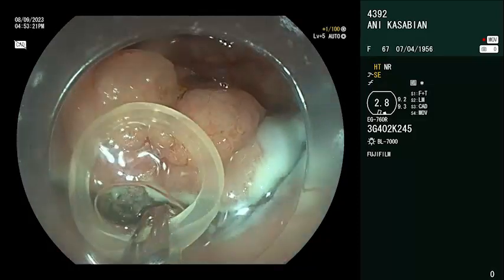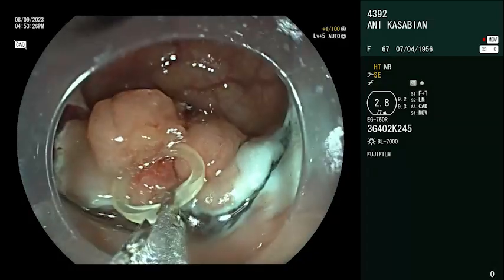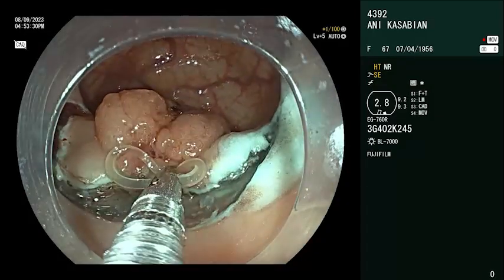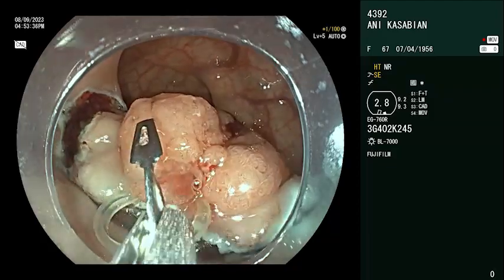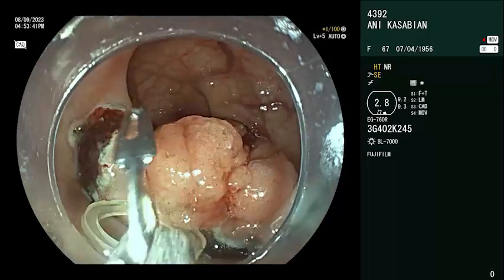Then I will grasp the specimen just here. Open, please, and close. Close. Okay. I think it's okay. Oh, yes. Open. Sorry. Yes. Sorry. That's I see. Yes. Okay.